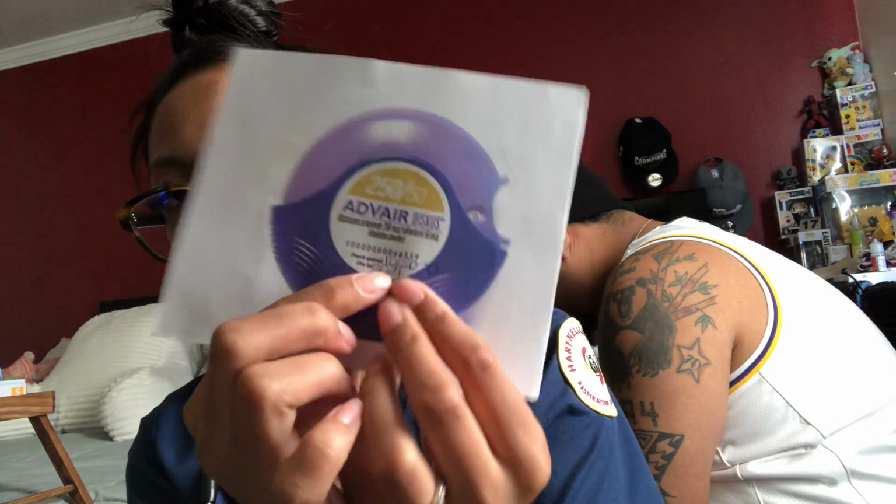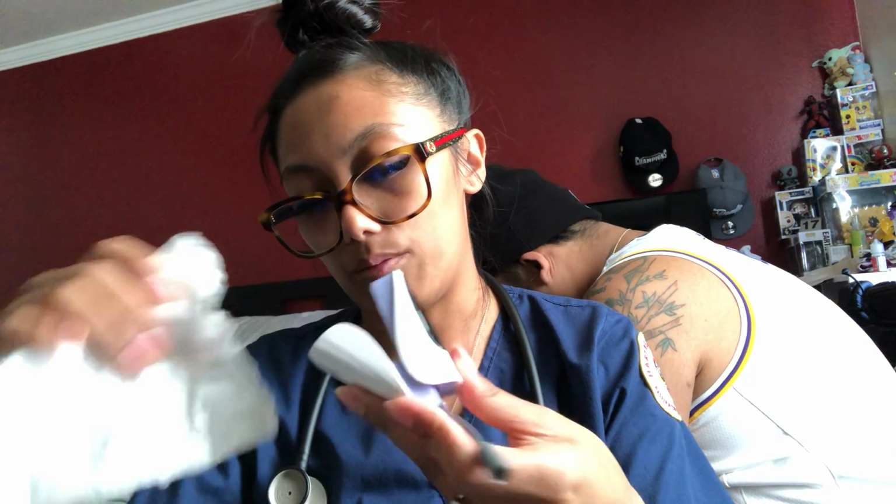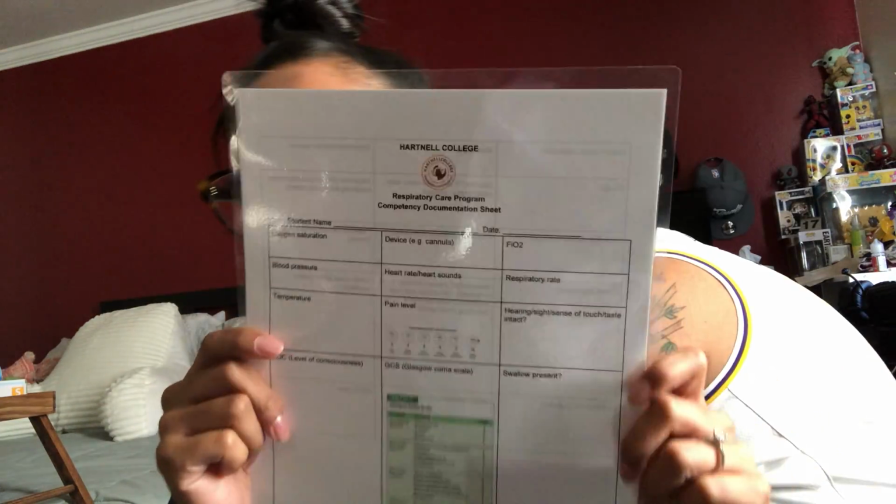I took it out of the box and wrote down the date that we opened the medication and the expected expiration date, so that just in case the patient doesn't finish the medication by then, they know when it's expired. I'm also going to have my stethoscope, which I am going to sanitize as well. I'm also going to need some extra hand sanitizer and a pair of gloves. I will also have my sheet to collect some information during the exam. So I'm going to sanitize my hands once again and then enter the patient's room.